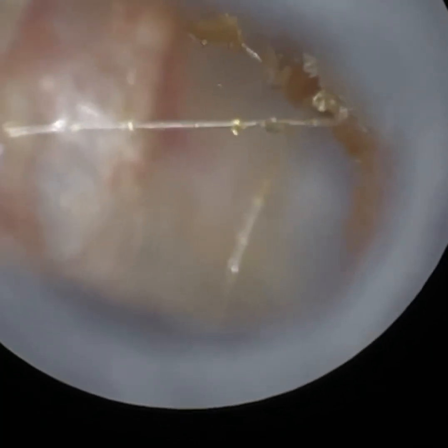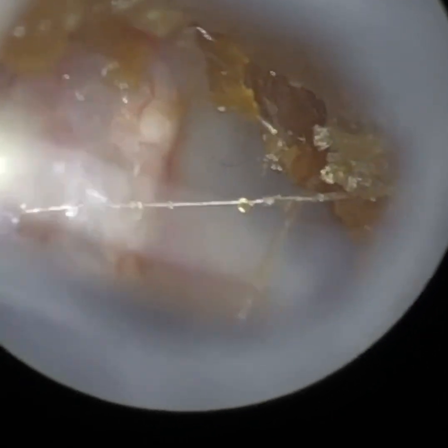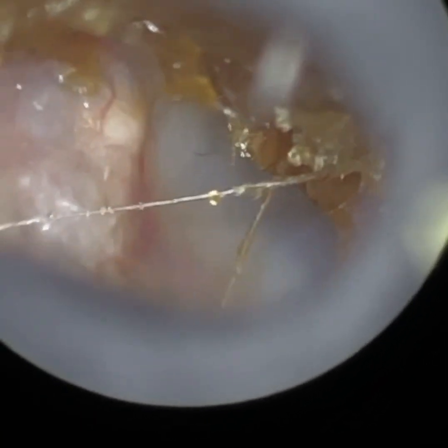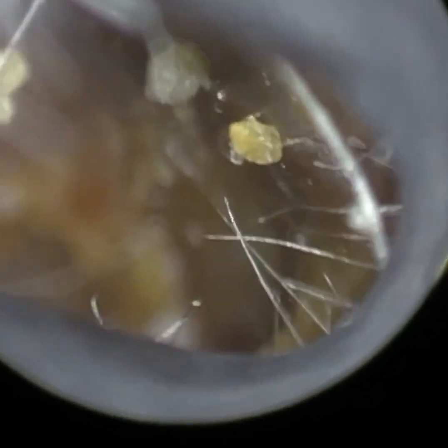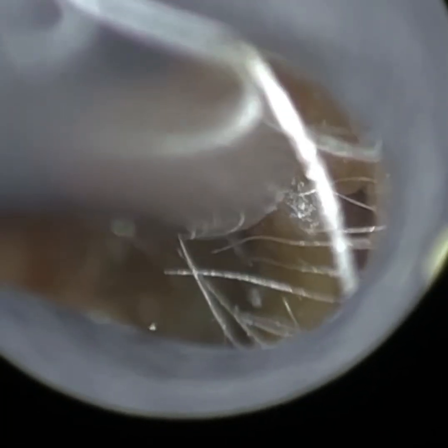The endoscope in terms of optics is unbelievable, but by far everyone else felt the Waxscope was head and shoulders above everything else in terms of wax removal. Because it's portable, it's lightweight, the view is stunning — the magnification, clarity, and focus are unbelievable. The only thing that is different between the Waxscope and the endoscope is the field of view, and that's unavoidable because the purpose of the Waxscope is to make it more user-friendly. It incorporates a speculum, so you no longer have to use the endoscope to stretch the ear open, which some people find difficult.